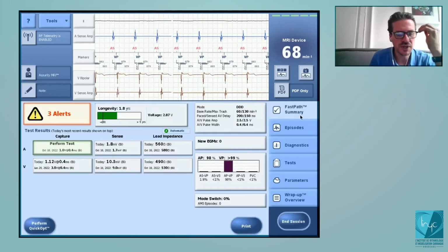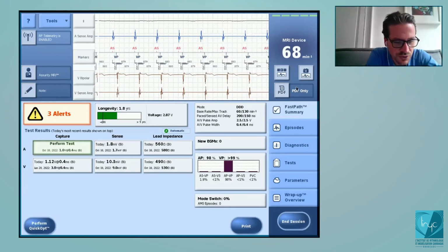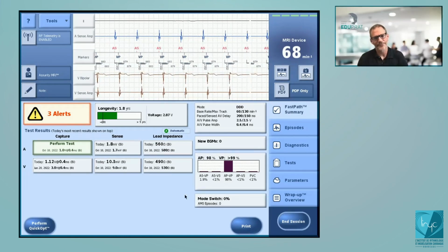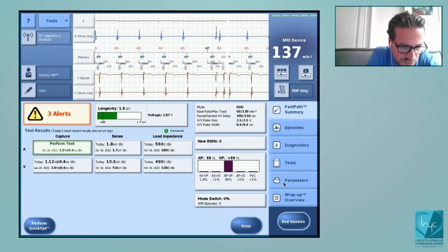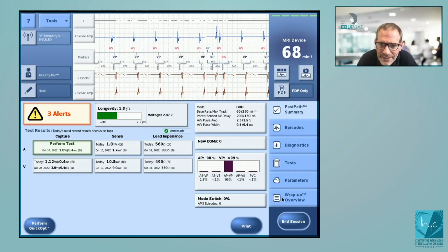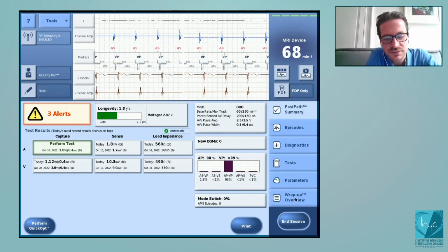So I think in this patient, the cap confirm was switched off. So you forced the programmer to do this test, and then it first wanted to calibrate, and then it did the test, and then it asks you, do you want to program the cap confirm in this patient? Exactly. It's a bit slow the first time, but the other times it will be faster. Mark, anything to add for Abbott devices? No, I think it's quite complete.